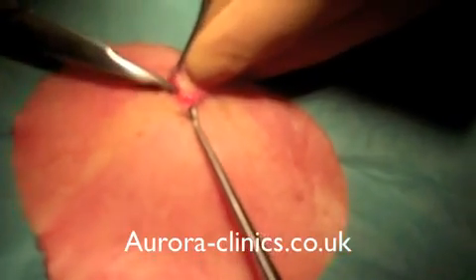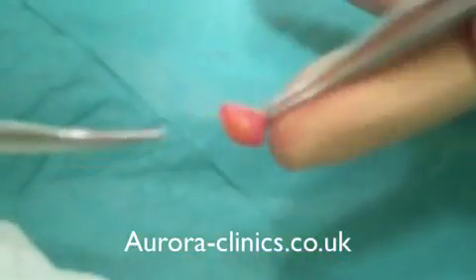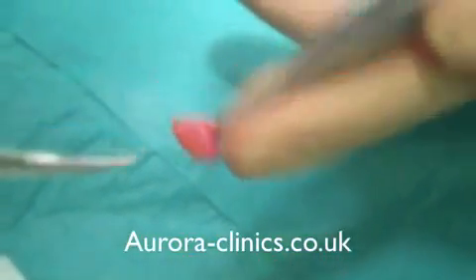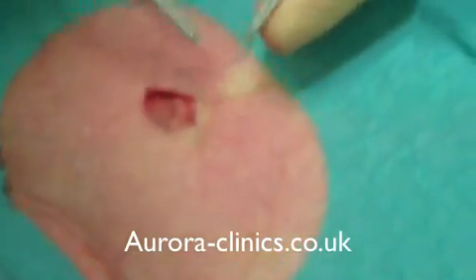Now this cyst has been infected. You can see there, unfortunately I've just burst it, but it's important, even if you do burst it, to try and get all the layer of the cyst out with the overlying skin ellipse.